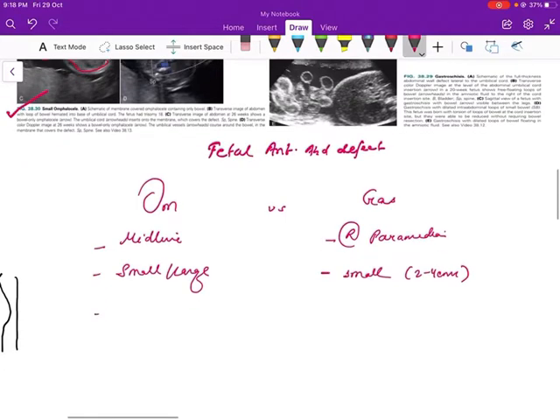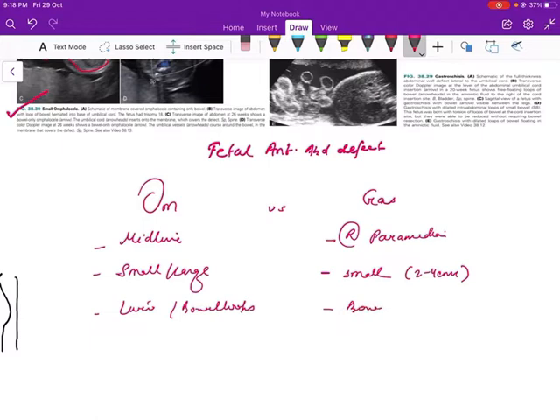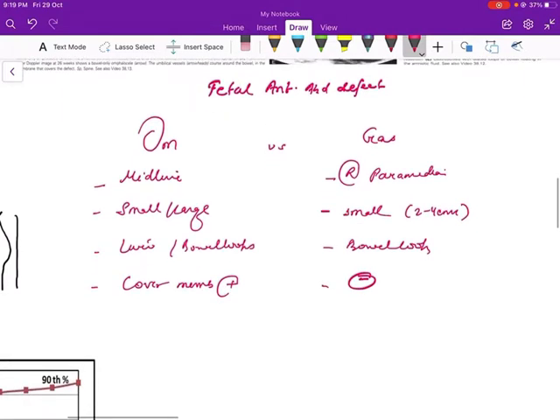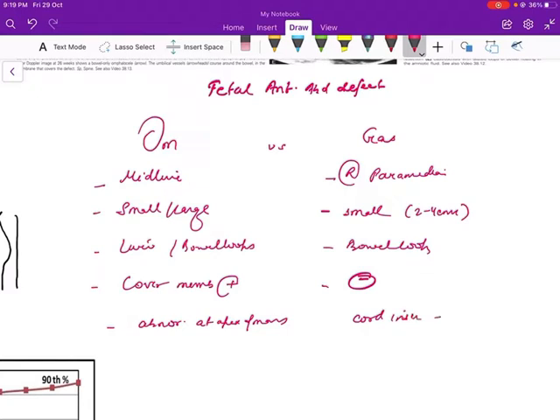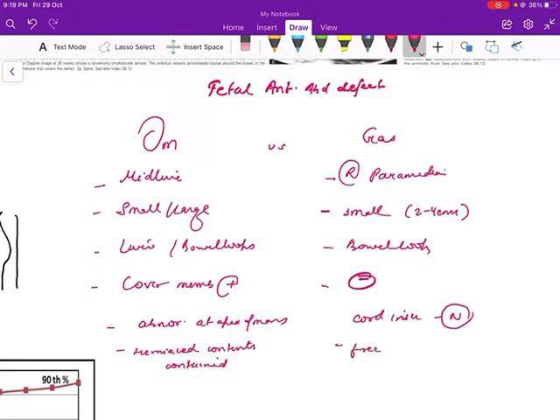The herniated contents in omphalocele can be liver or bowel loops, while in gastroschisis there are generally only bowel loops. In omphalocele, a covering membrane is present, while in gastroschisis there is no covering membrane. The cord insertion is abnormal in omphalocele — attaching at the apex of the mass — while cord insertion in gastroschisis is normal. The herniated contents in omphalocele are contained by a membrane, while in gastroschisis they are freely floating.